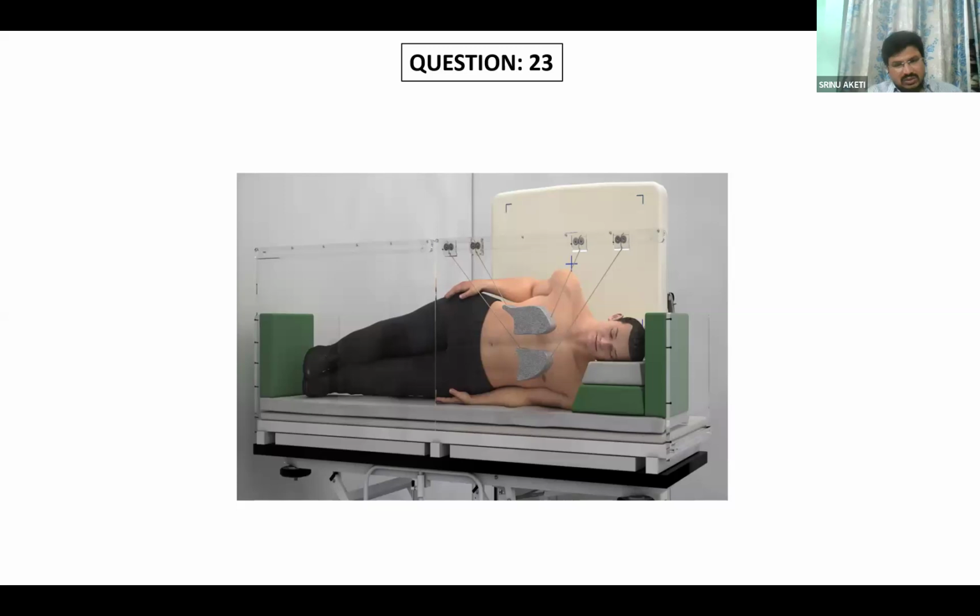Do you know other positions? In treatment, actually, the bilateral technique and APPA, sir. In the bilateral technique, they will be placed either in a seated position or in a lying down position.